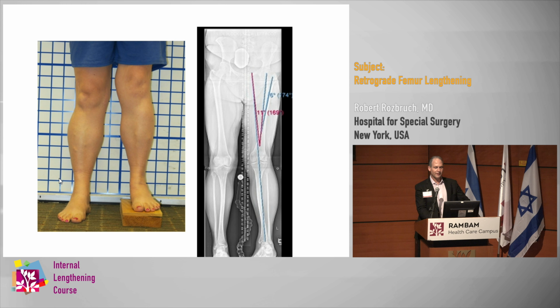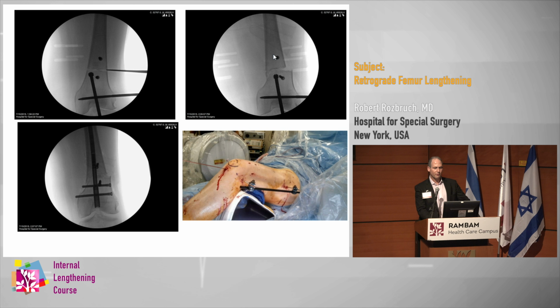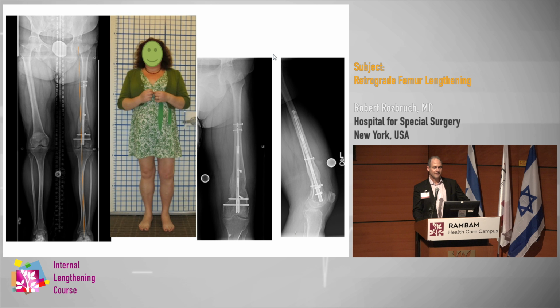You see the fixator pins. You see the multiple drill holes have been made. You can see the path of the nail with the retrograde reamer, right? The osteotomy is done. The deformity is corrected. It's held in place with the 2-pin X-fix. Then the guide wire is passed. The reaming is done. And then the nail is placed with acute correction of the deformity. And then the lengthening follows.